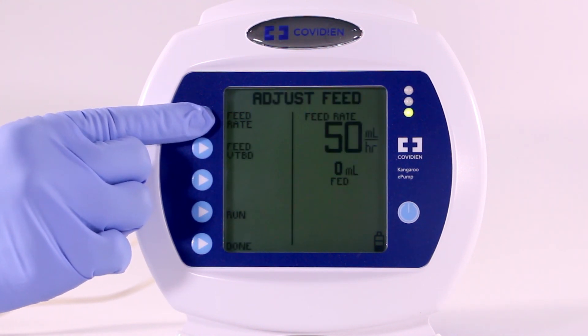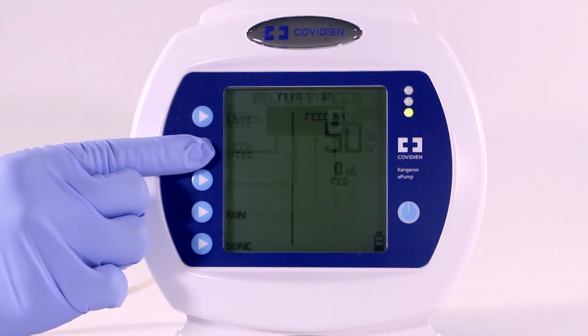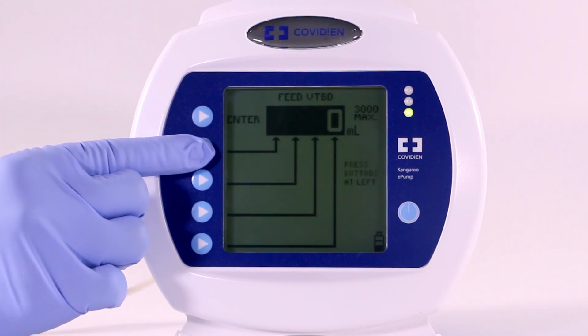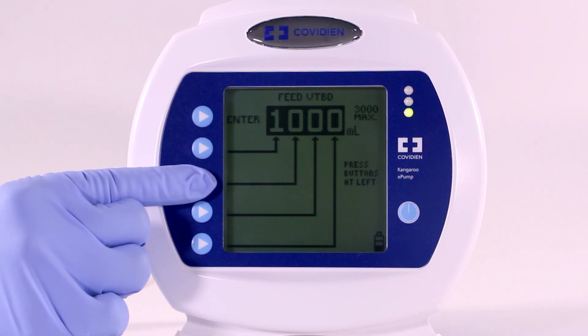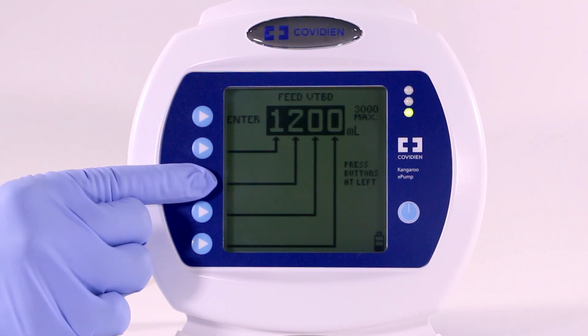If you'd like to set the total volume to be delivered, select VTBD and input the total volume to be delivered. Press the buttons to select the feed volume. Volume to be delivered is an optional feature. Only use VTBD if you want the pump to stop and alarm once the set amount of formula has been delivered.